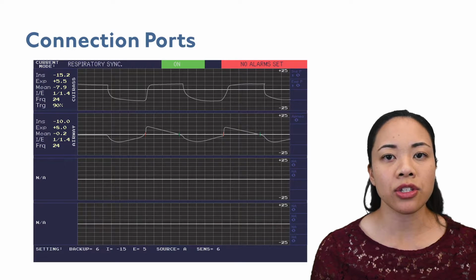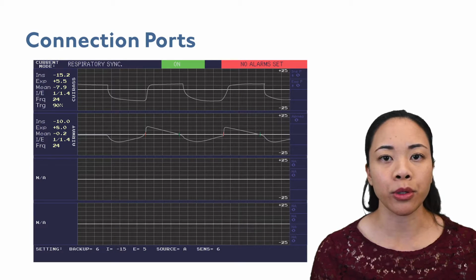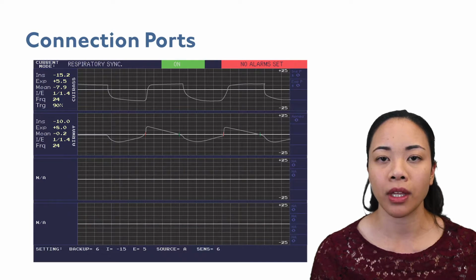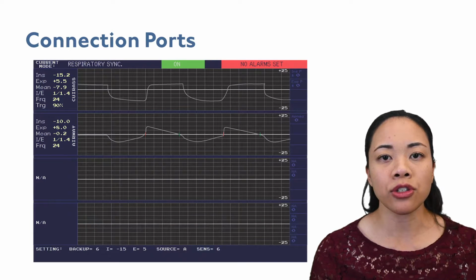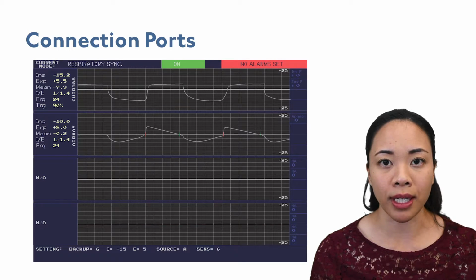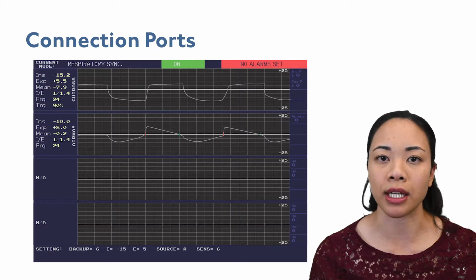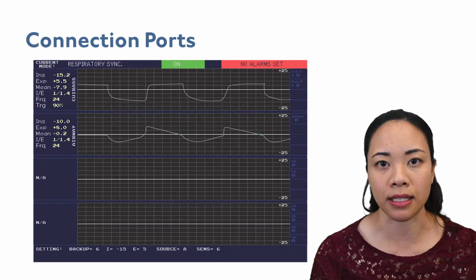And last, the top of the screen will either be blue and read standby or will be green and read on. Note, if attempting to start the machine and it is not yet green, stating it is on, you may need to press it again with a lighter touch, as the keypad is sensitive.